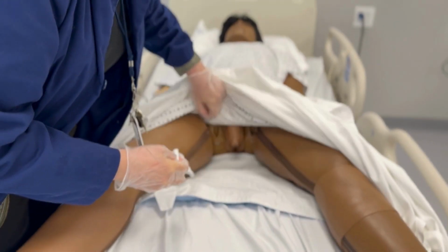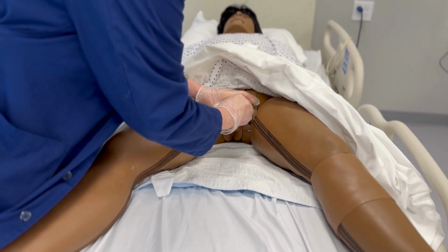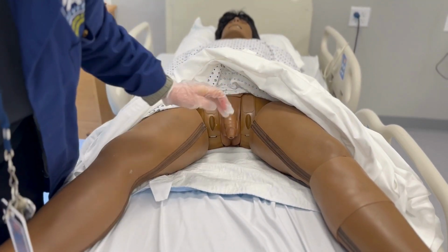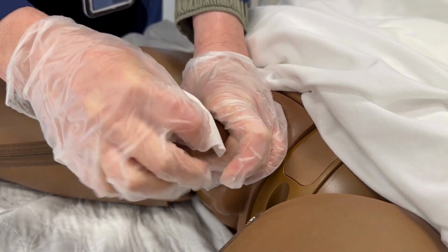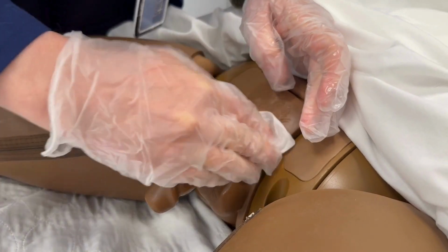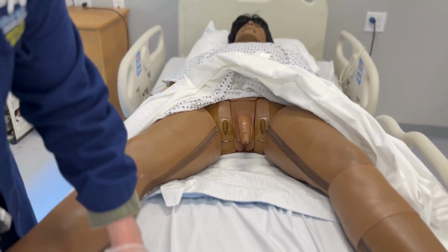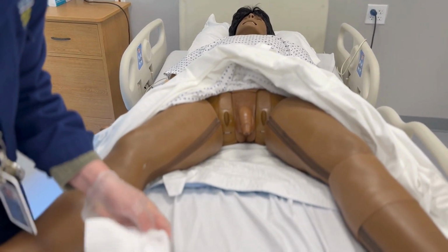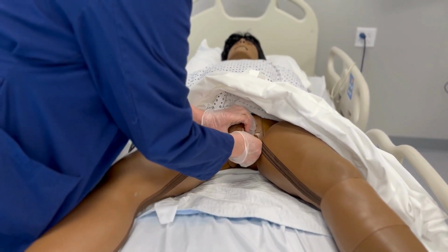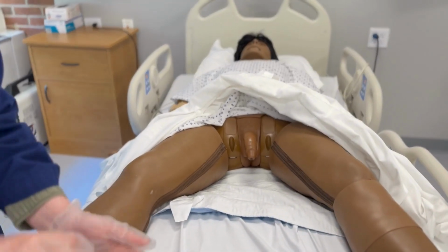Cleaning the tip of the penis first in a circular motion from meatus outward to shaft and then pubic area. Remove gloves and perform hand hygiene.